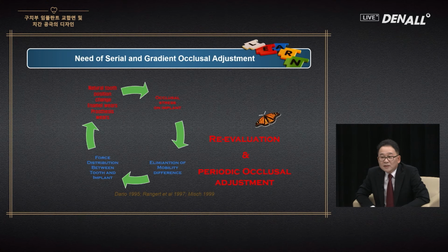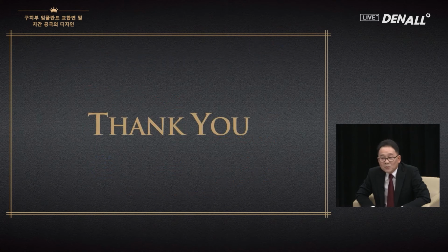For all preventive actions, periodic occlusal adjustment and recalls are very important. Checking it again and again to prevent problems. Thank you.